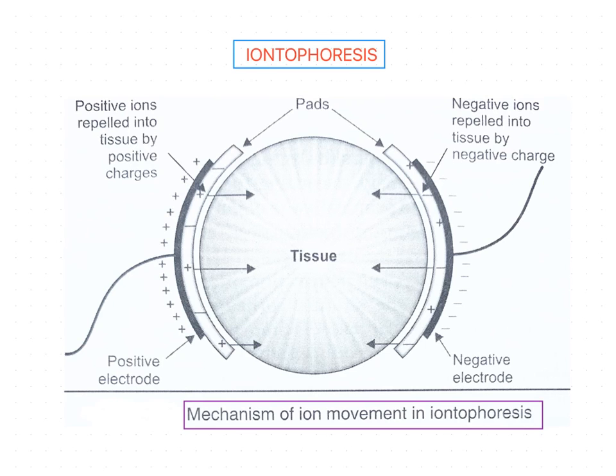Normally, when a voltage is applied to an electrolyte, we have a positive pole and a negative pole in the electrolysis, isn't it? So what happens? There is movement of positively charged ions towards the negative pole. For example, this one is negative and this one is positive.